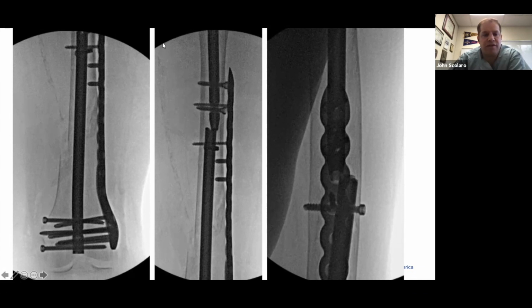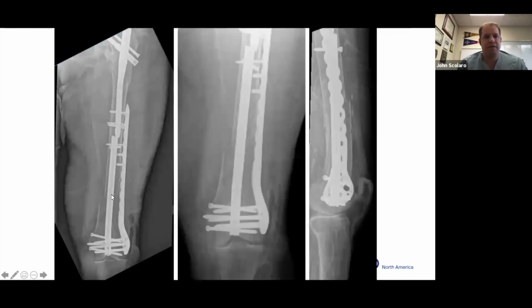So one of the things that I do want to mention, and this is not published currently, but the original description of this technique says utilize the smallest diameter nail possible in order to maximize opportunities for fixation. But the actual nail diameter does make a difference here with regard to the biomechanical strength of the nail plate construct. So I've actually gone to using not just an 8 or 9 millimeter nail reflexively, but utilizing a larger nail when possible. So you can do nail first or plate first. I don't think it really matters. It's just trying to get creative with maximizing fixation in the distal segment.